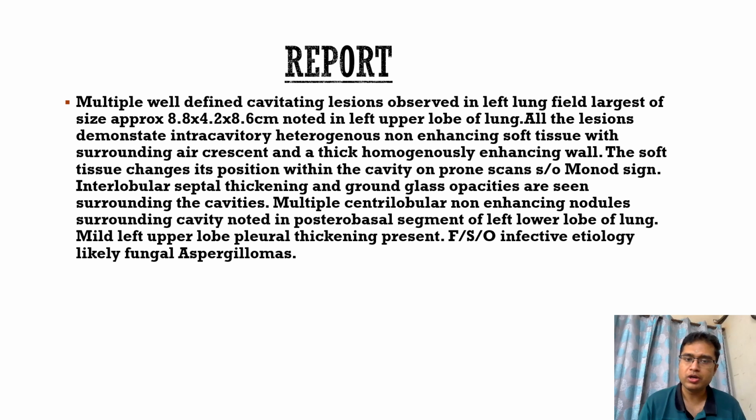And there was some interlobular septal thickening and ground glass opacities were also seen surrounding these cavities, and multiple centrilobular non-enhancing nodules were also seen in the posterior basal segments of the left lung. So features were suggestive of a fungal aspergilloma.